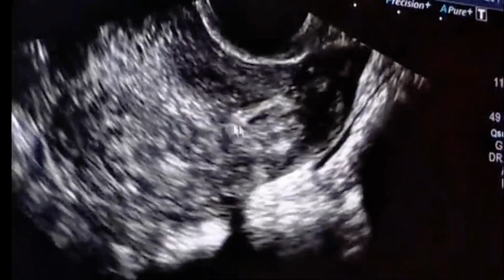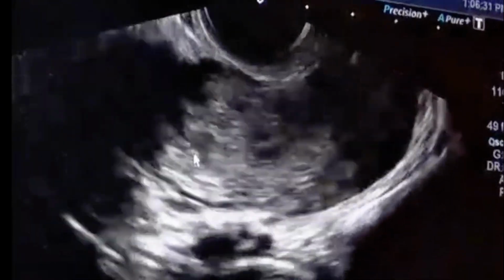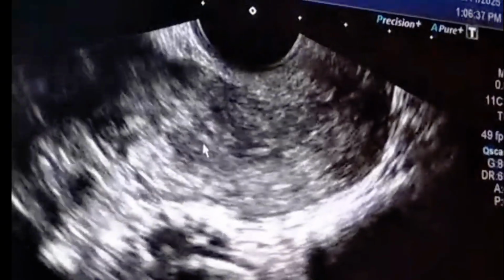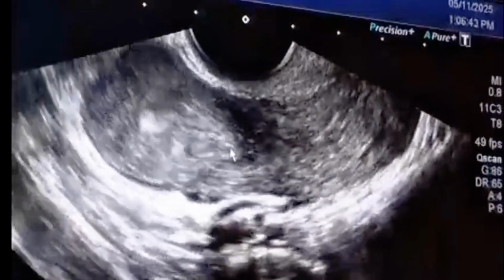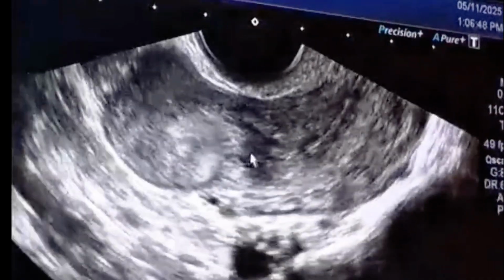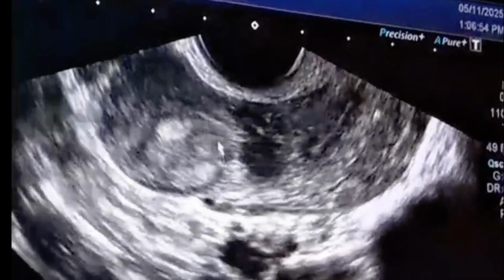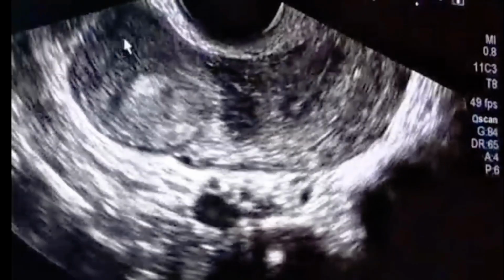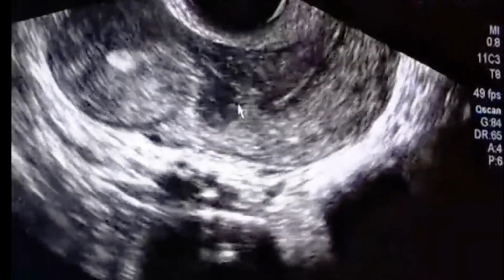But the other thing I want to check is this area. You see this is another echogenic lining area. This is also connected with each other, and when we see the fundus, this is the fundus, and there is a mass in this area, but it also has an echogenic lining like an endometrial lining, and it is connected with the uterus.